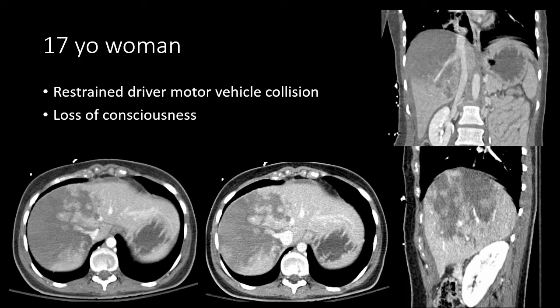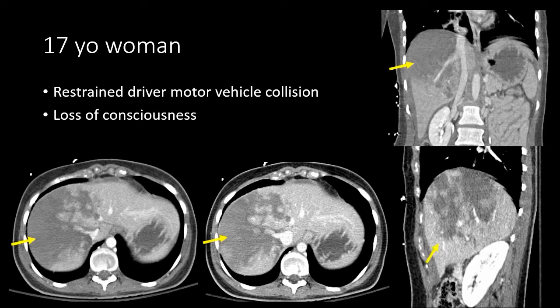Another 17-year-old woman was in a motor vehicle collision — this time wearing her seatbelt — also with loss of consciousness. We can see extensive injury to the right hemi-liver with poor perfusion and heterogeneity of almost the entire right hemi-liver, which we would consider parenchymal disruption. This injury extends right up to the intrahepatic IVC and involves both the middle hepatic vein and the right hepatic vein, visible in the middle of this parenchymal disruption.